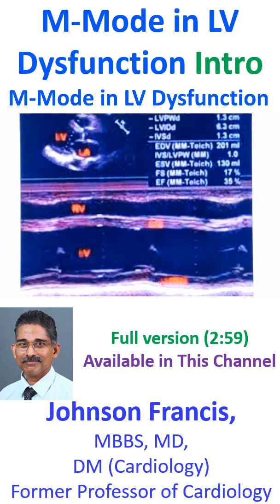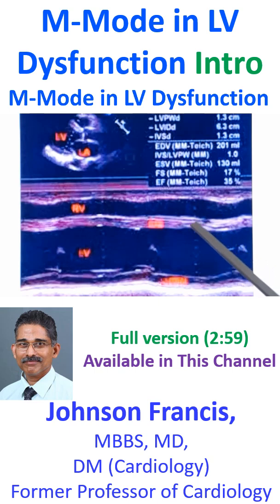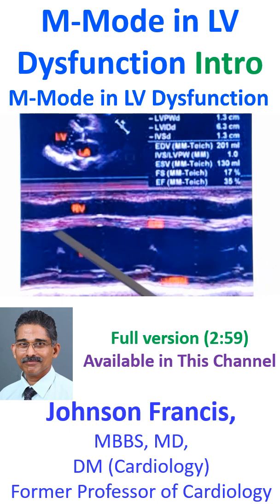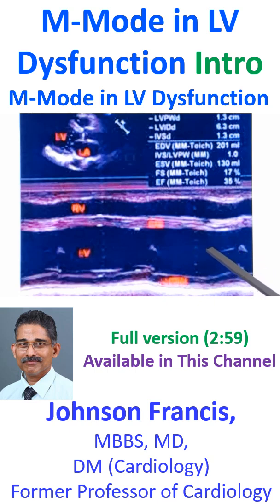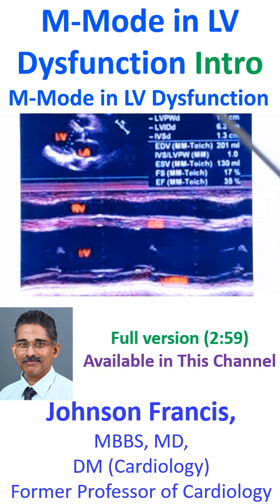This is a still image of an M-Mode echocardiogram. M-Mode is time motion mode. The horizontal axis is time, and the vertical axis is distance from the transducer. M-Mode is one of the older modes, currently used mainly for taking left ventricular measurements.